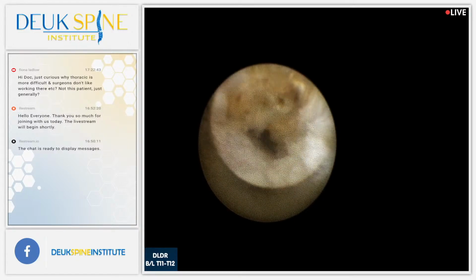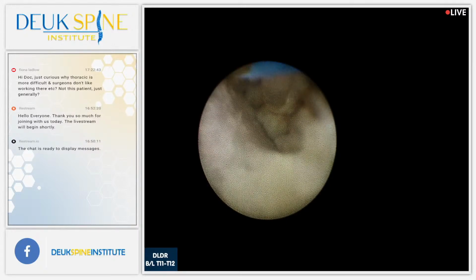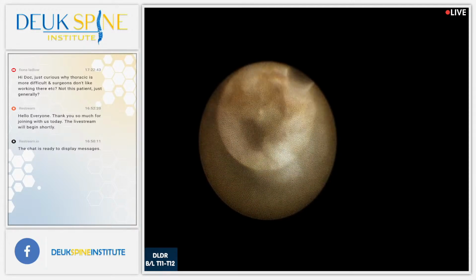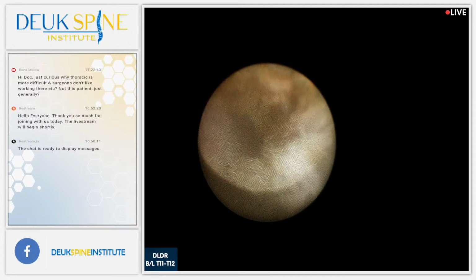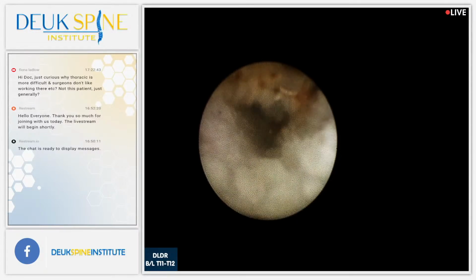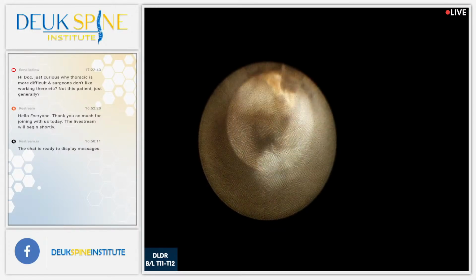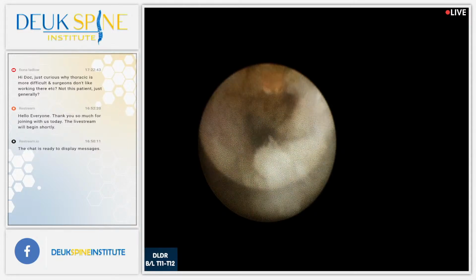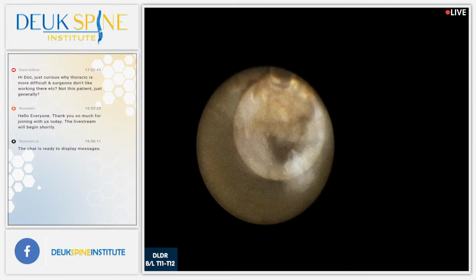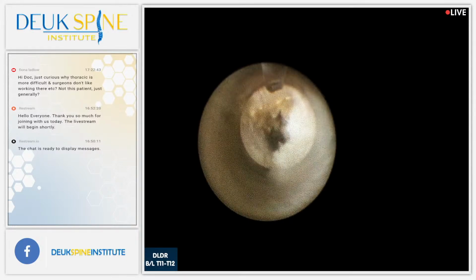And this herniation, this is hard. Look at that piece of herniation right there. Everyone says crab meat because it looks like crab meat, but it doesn't feel like crab meat. I say shrimp, but this old calcified herniation is not like shrimp. It's more like, what's the word I'm trying to think? Do you guys know what a mimolette is? It's a type of cheese. It's a very firm, hard cheese.